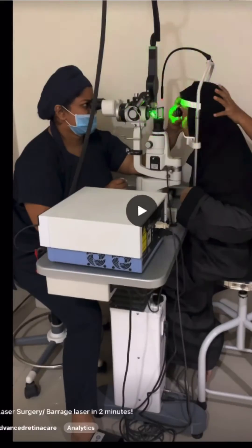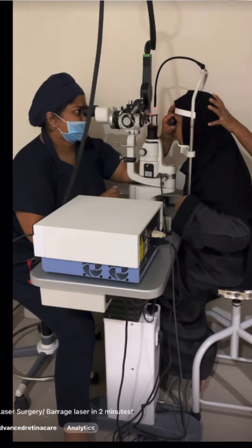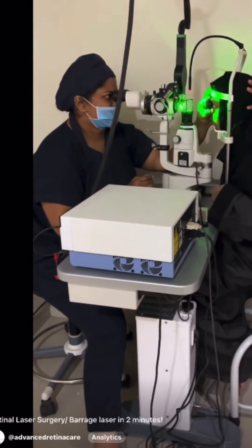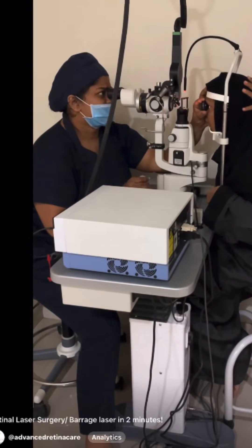A drop of anesthetic is applied on your eye, and then a contact lens is applied on the eye and a laser beam is passed through this onto the retina. So actually there is no pain — there is probably a sensation that something is touching the retina. You'll hear a sound if the doctor turns on the sound for the laser. And this takes about two to five minutes. That's all it takes.